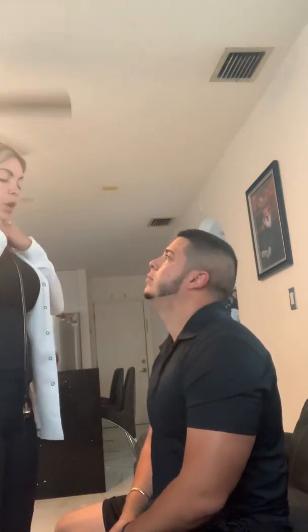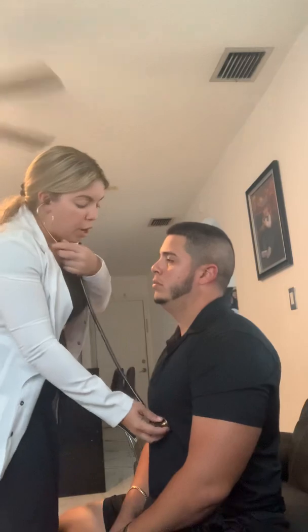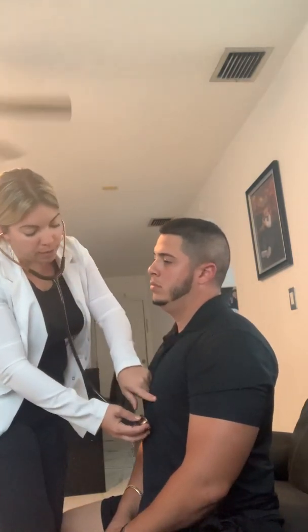Okay, also I'm gonna be listening for S1 and S2. So S1 is best heard at the apex of the heart, which is the mid-clavicular line, 5th intercostal space. That's where we best listen to S1, and to know if it's S1, we can also listen while touching the carotid and feel the pulse, so that way I know that it's S1, and S2 is best heard at the base of the heart.